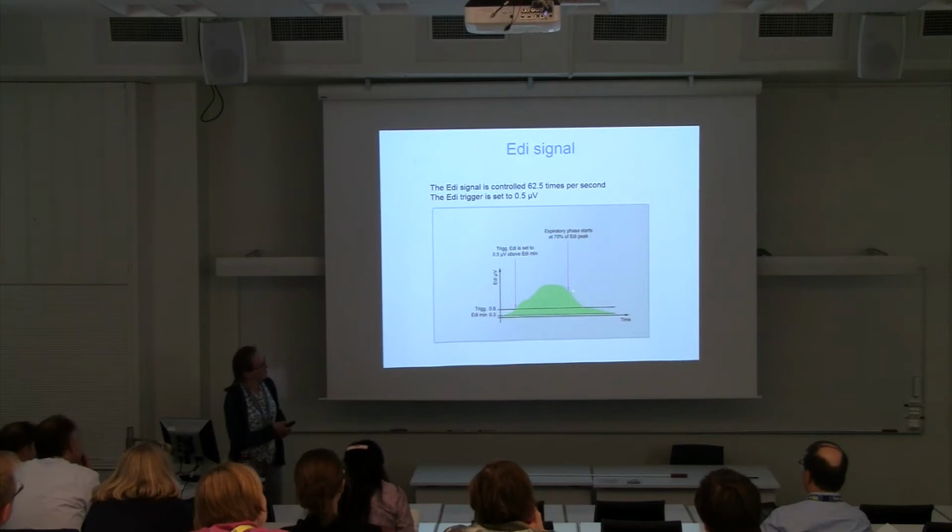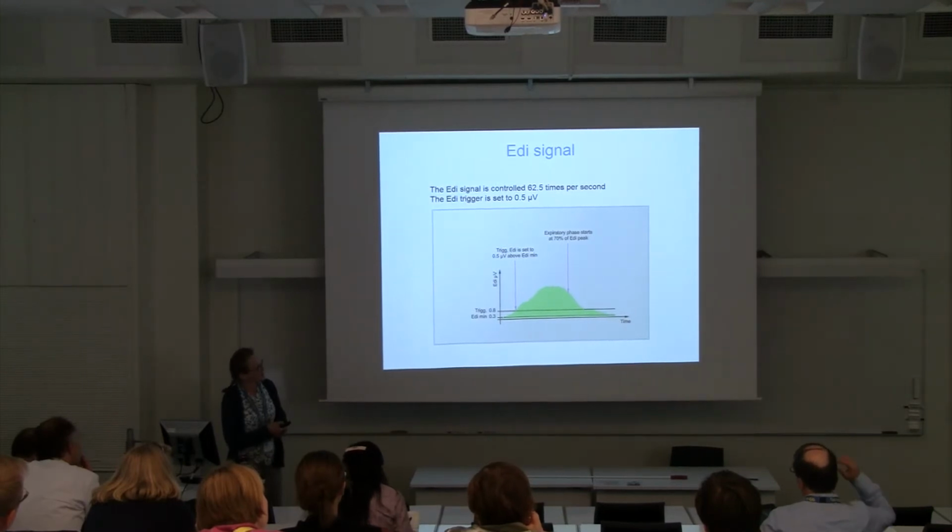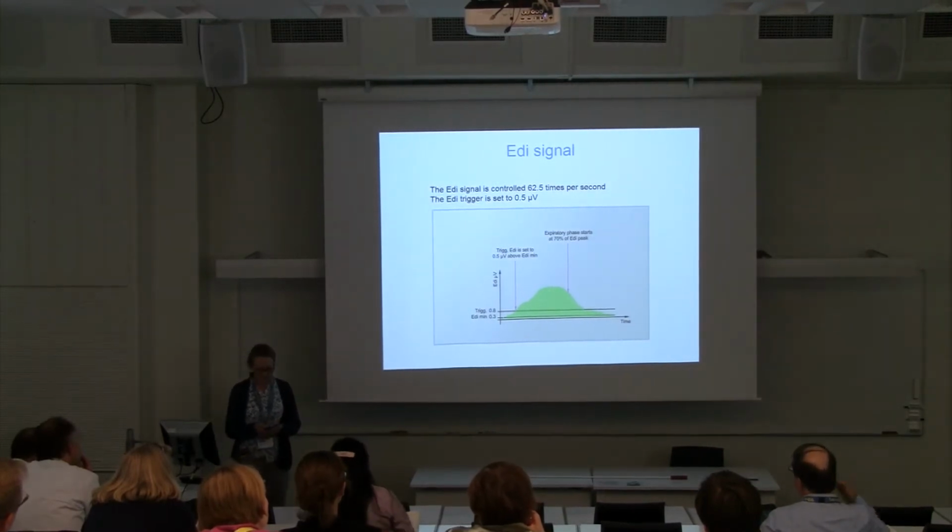Here you can also see how the expiratory phase starts. It starts at 70% of the EDI peak.